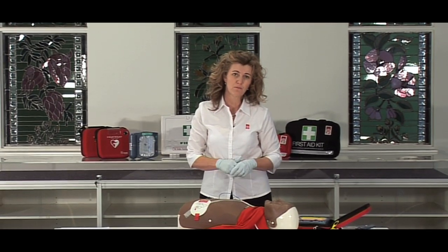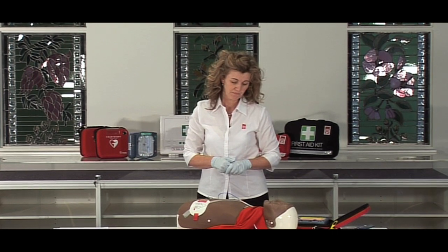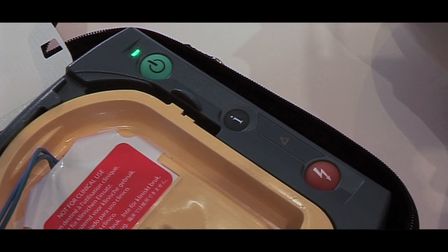It's analysing what the heart rhythm is doing. No one should touch the patient while it is analyzing.